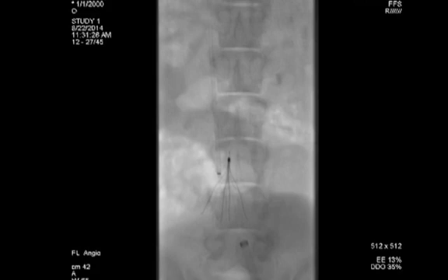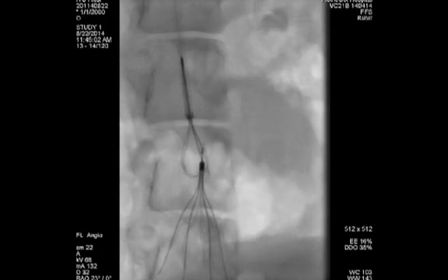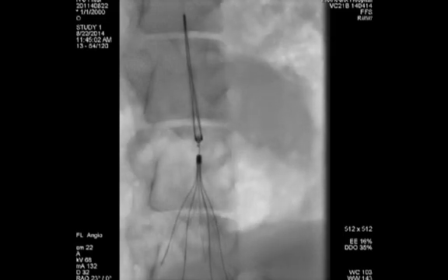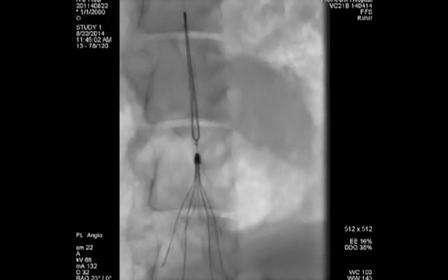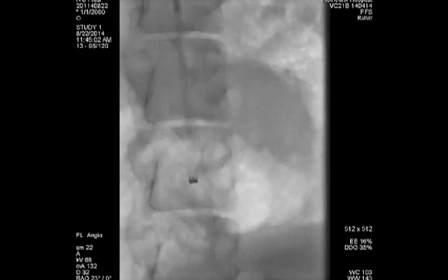You can see that the catheter has been brought down from the jugular position. The robotic catheter is very easily controllable and we can bend it from side to side. The snare can be introduced through the robotic catheter and then, as we close the catheter millimeter by millimeter, the Magellan can be advanced, making sure that we snare the apex. Then in a very controlled fashion — that's the real advantage of this — you can advance the snare, collapse the legs, and manually pull on the filter, and you can see it can be fairly easily retrieved.